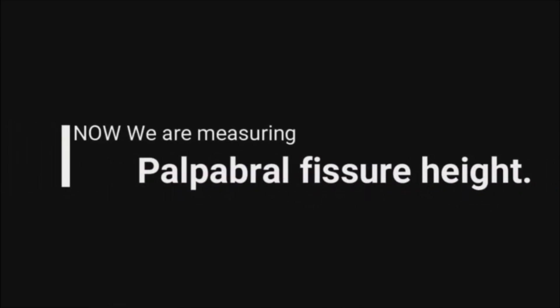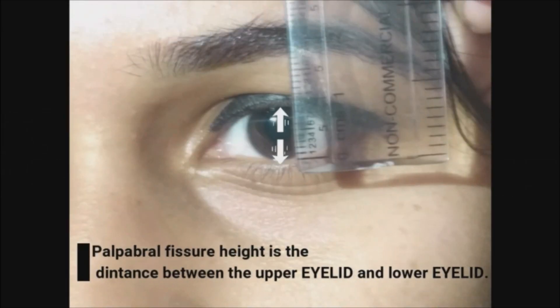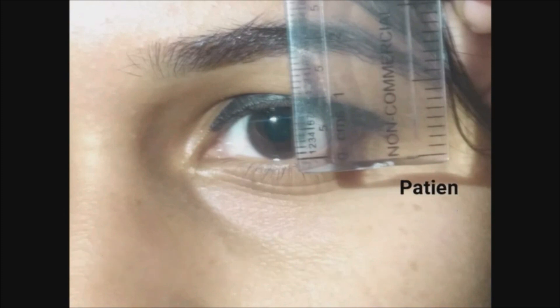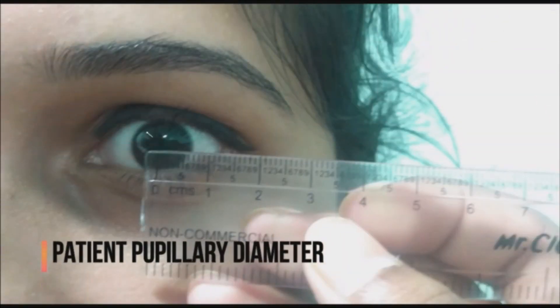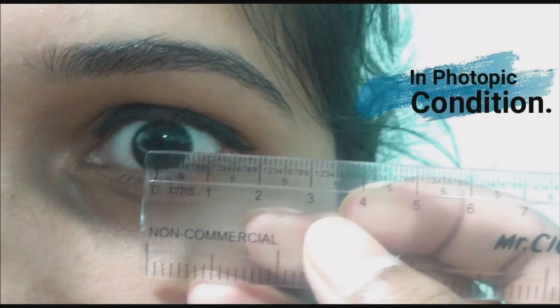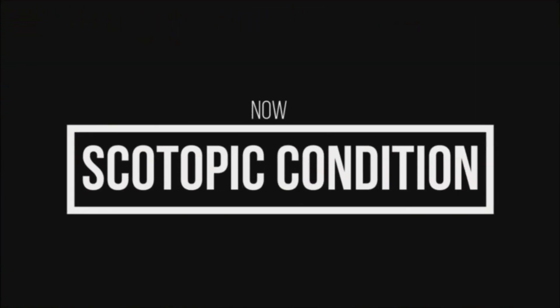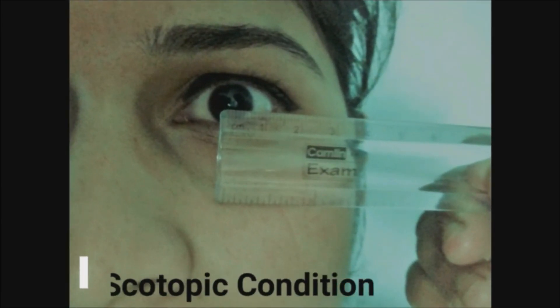Measuring the palpebral fissure height, which is the distance between the upper eyelid and lower eyelid. The patient's palpebral fissure height is 11 mm. Now we'll be measuring the pupillary diameter. The patient's pupillary diameter in photopic condition is 4 mm, and in scotopic condition it is found to be 5.5 mm.